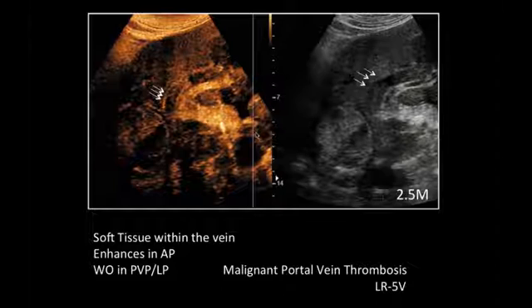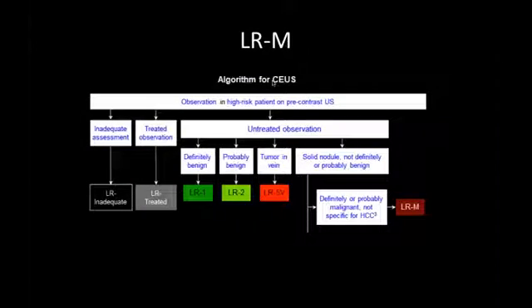And then in the portal venous phase, we're looking for two types of washout: early occurrence, less than 60 seconds, and with a marked or punched out appearance so that it's very black at the time of its first observation. Now, a very important issue for imagers is that any one of these observations alone qualifies the lesion to be LRM, and so this makes this very, very interesting and easy to observe. So let's look at a couple of patients.